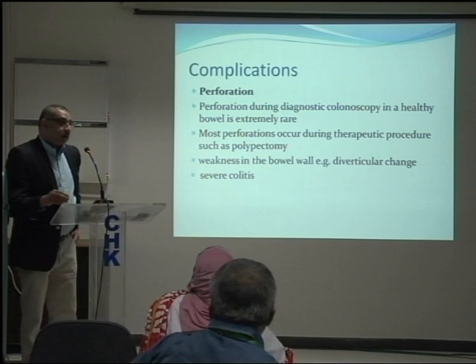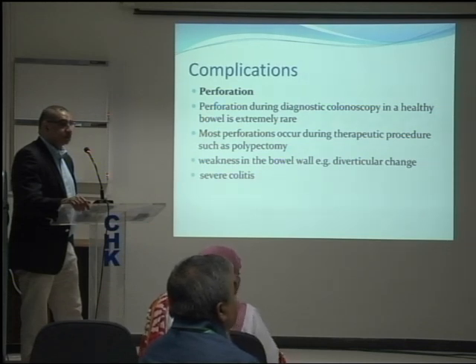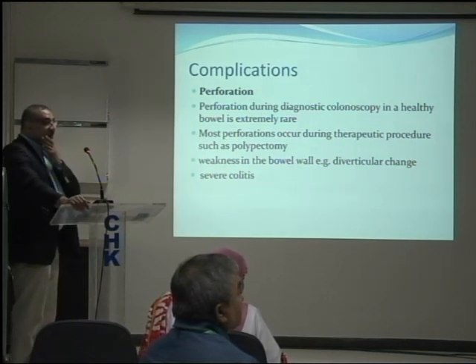Right, okay. Were the patients actually told, and this brings us back to consent, did they have any idea that they were going for this little procedure, which is what we tell them, and they would end up having a diverting colostomy, or end up getting surgery? The reason I raised this point was twofold. One, we discussed the management of complications, but I will take us through it. But the second, more important thing was that if in consent you haven't mentioned the possibility, and this happens, then you've got a big problem in front of you. But if you've mentioned it, then you don't. So when you're taking consent, you need to inform the patient about the risk and complication, and hence the emphasis was more on this than on other aspects of basic training that we generally did. So you can go ahead.